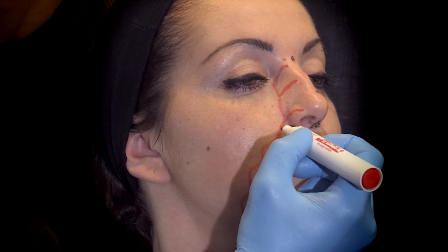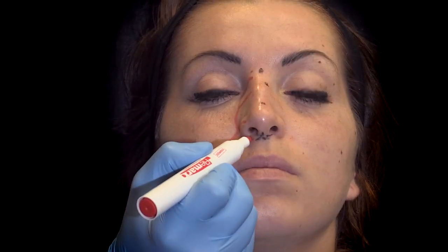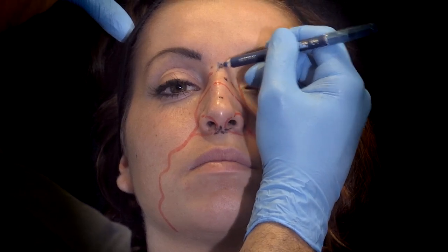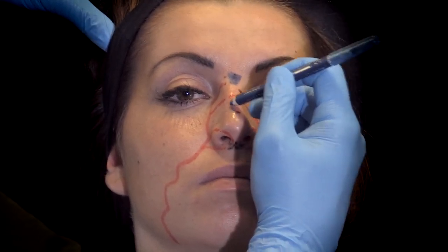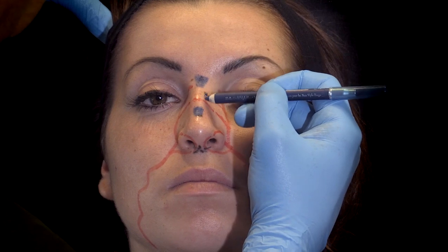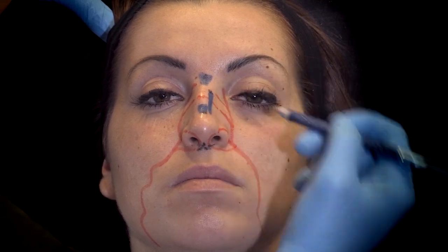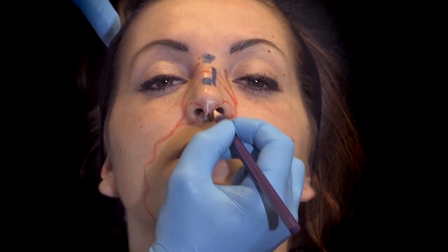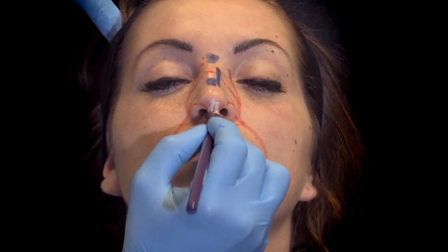The main danger is at the upper part of the nasolabial fold. So if we stay medial, we minimize the risk of problems. Have a look at where we want to deposit the gel, always medially, away from the big vessels. And the pyramid, the Eiffel Tower, will be safer injected on the columella, away from the vessels.